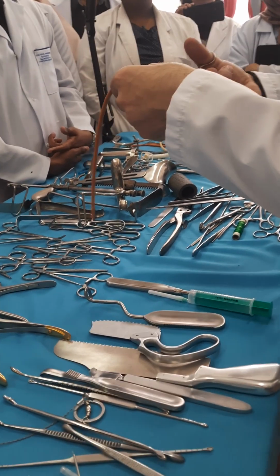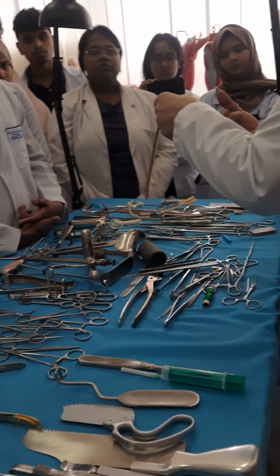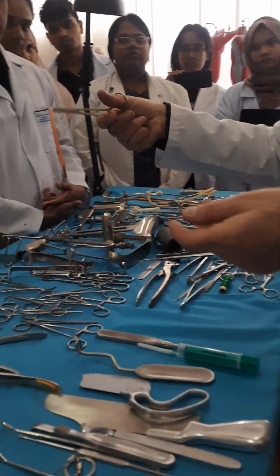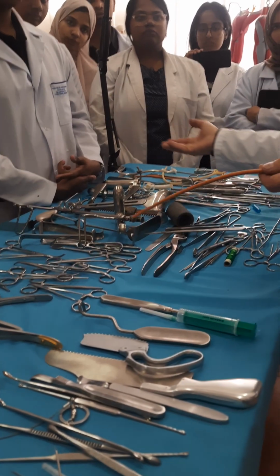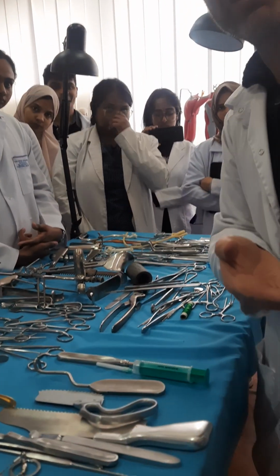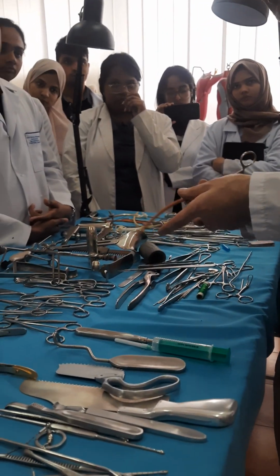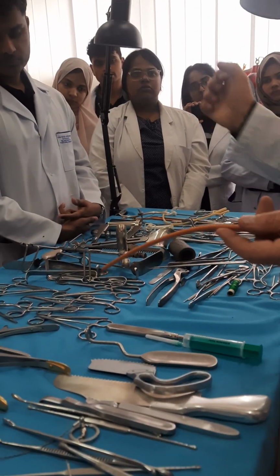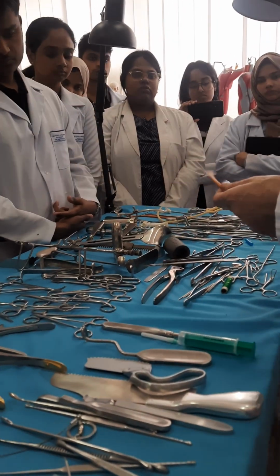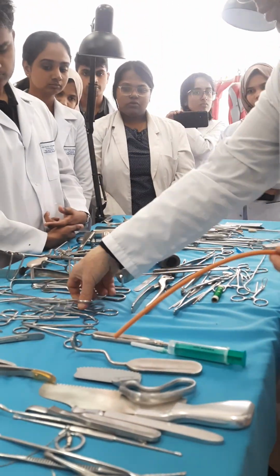That is a stupid way. You don't clip these teeth in the wall of the vessel, you put them in the neighboring structure for better gripping, but according to what is neighboring. If neighboring it is another artery, it will be stupid to use it. If neighboring it is fat or muscle, yeah, you can use it, no problem. It will give strong fixation. That's all about group number 2.